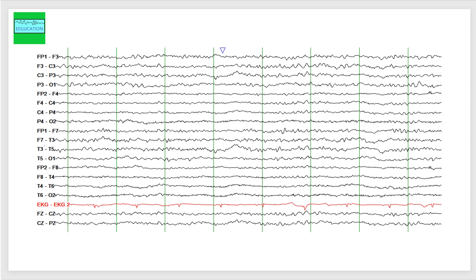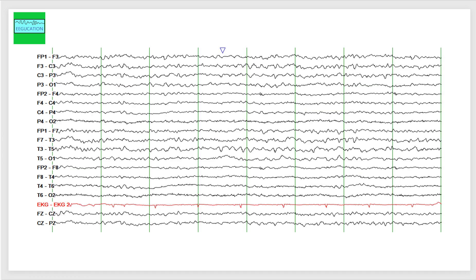Looking at another snapshot from the same patient, you can see the asymmetry between the left and the right hemisphere. When you dictate an EEG which has asymmetry between the two hemispheres, it's important to dictate each hemisphere separately. And then you can comment that there is a marked asymmetry between the left and the right hemisphere.